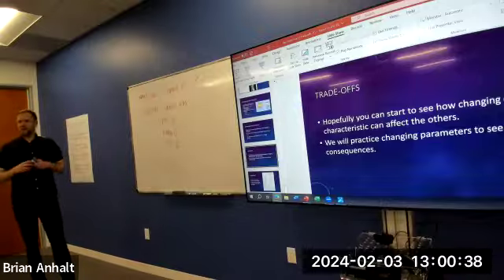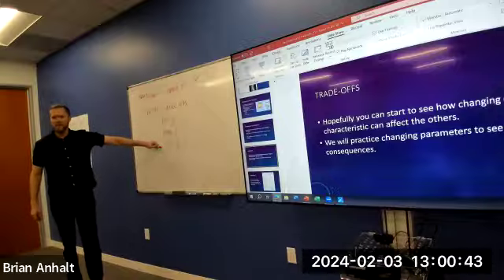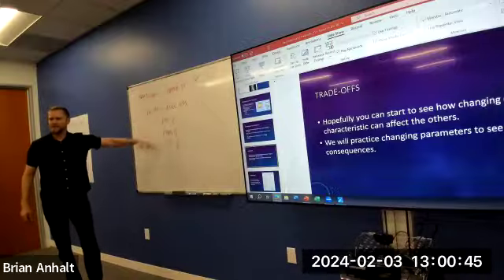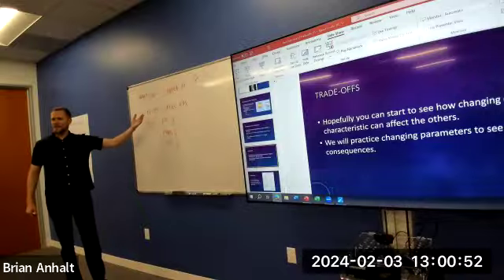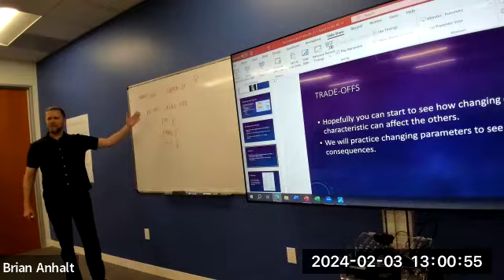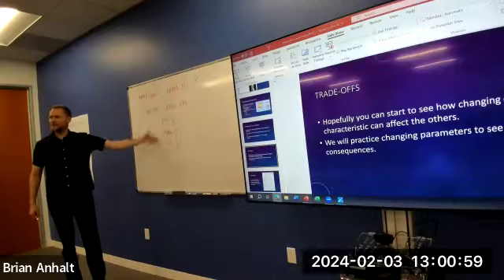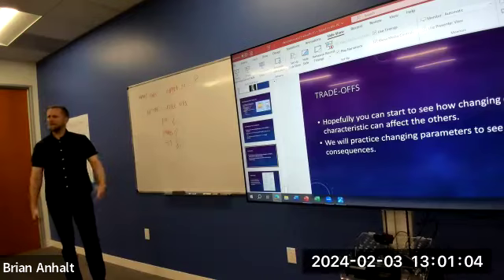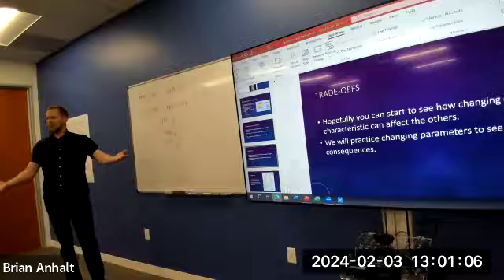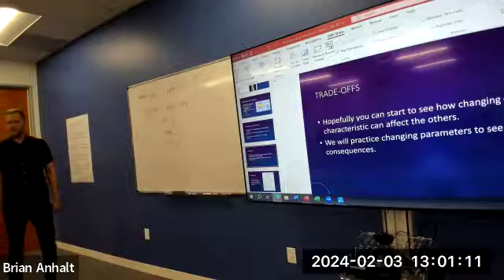If my image is blurry or fuzzy and has low resolution, this is what I need to do. I'm going to give you a bunch of options. I did this, and this, and only one of them is going to be the right one. I might increase the TE, I might do something to scan time, I might change the bandwidth, but this is the only thing that's going to matter as far as resolution. I might actually go the opposite way and increase the voxel volume. Is that going to work? That's going to be the wrong answer. You want to decrease that voxel volume to get better resolution.